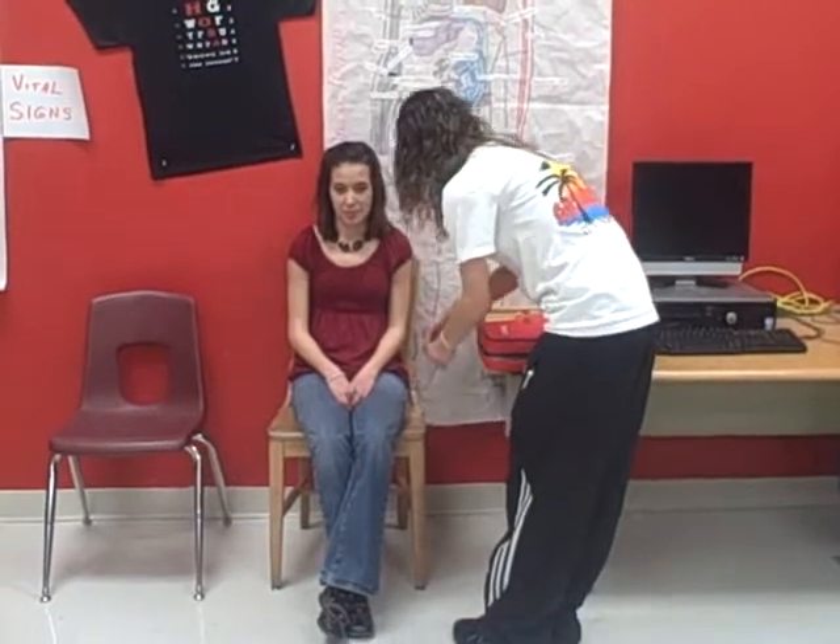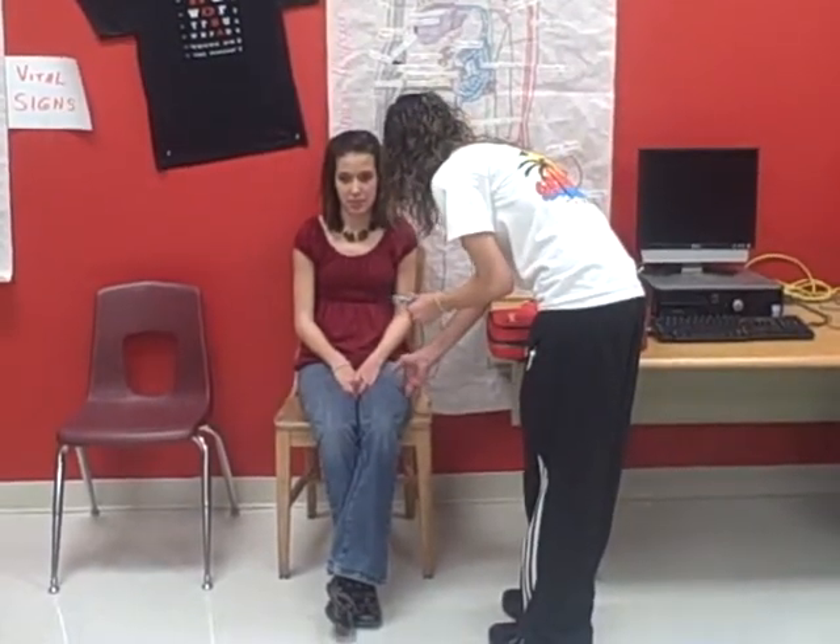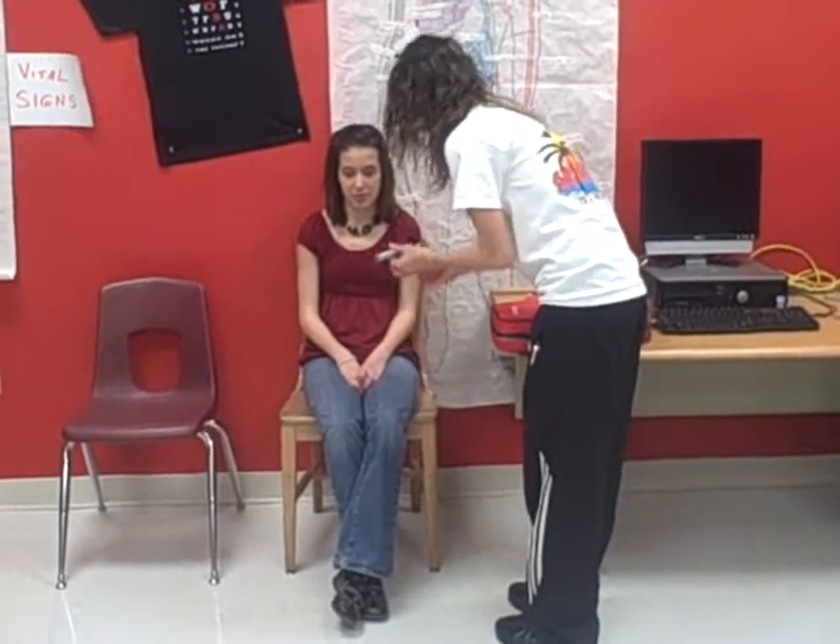I remove it straight out and apply pressure. Then I will put my cap back on and dispose of it safely with the needle down.